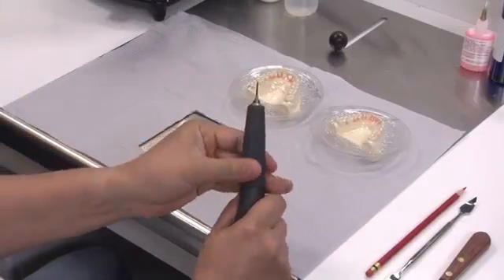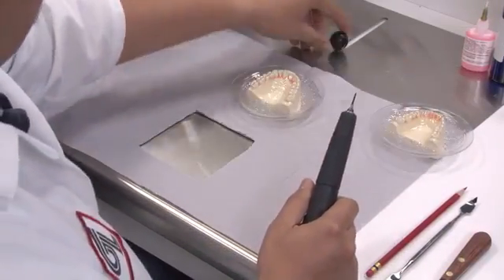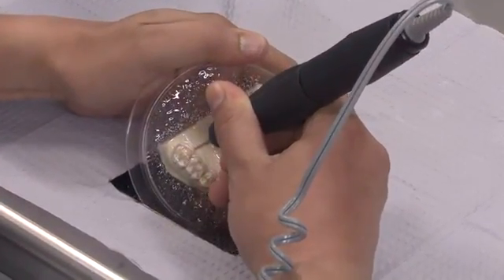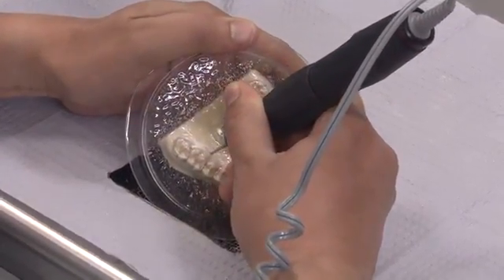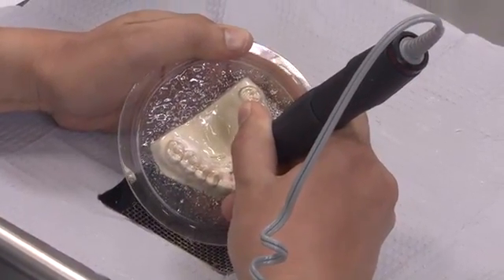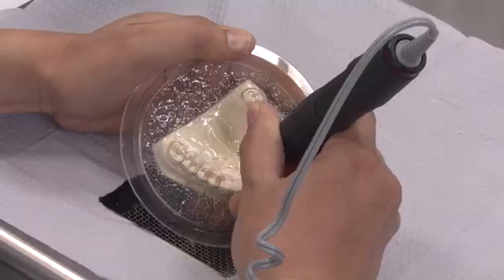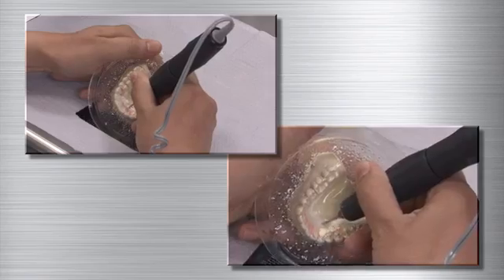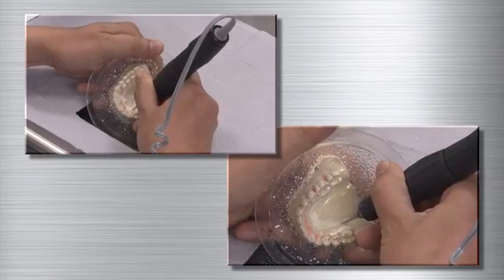Load a Brasseler H219 cutting burr into a low-speed handpiece. Start cutting the material on the lingual of the model. Cut in the shape of the teeth about 2 mm from the gingival edge. Do the same with the opposing tray.